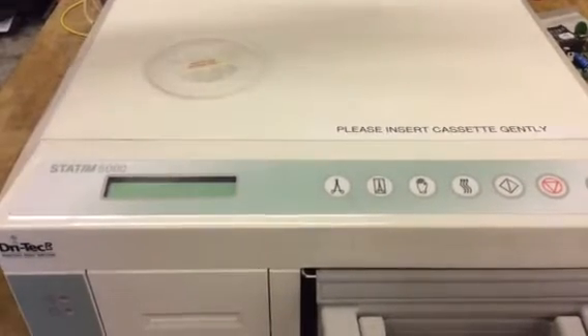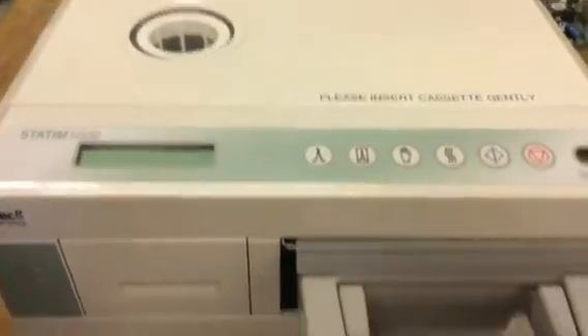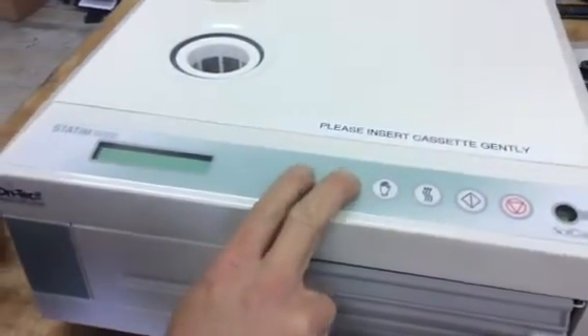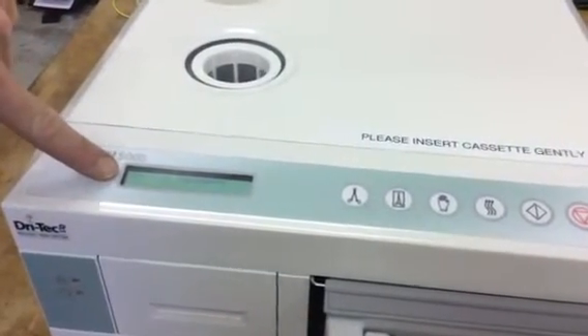Make sure it's plugged in, make sure your reservoir is full of water, and make sure your cassette's in. You're going to hold down the unwrapped button and the wrap button at the same time, and then you're going to power up the machine so that you see the service password screen.